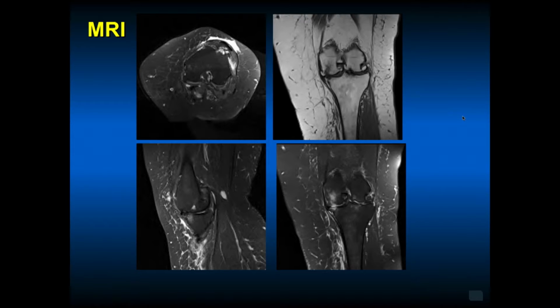So I spend a lot of my time in clinic looking at MRI scans from outside images. Imaging centers may not be the best scan. So severe osteoarthritis that we could see on the plain films, or we could see in the forest view, so to speak, and now we got a lot of trees in here, where the patient has read how many bad things are in her knee, such as torn menisci. She's wanting to have a scope done, which is not indicated and should not be done.